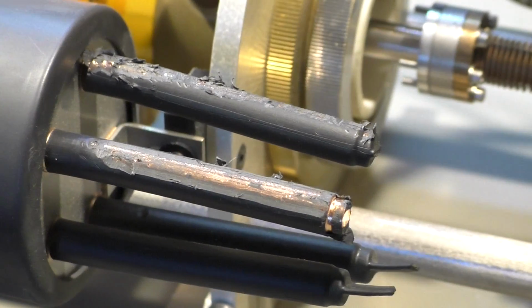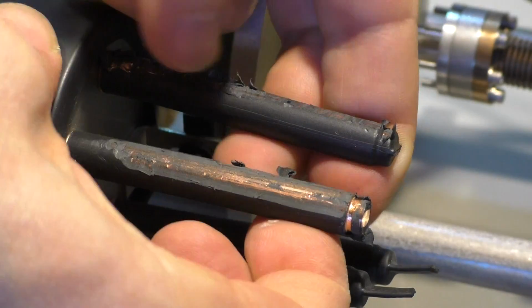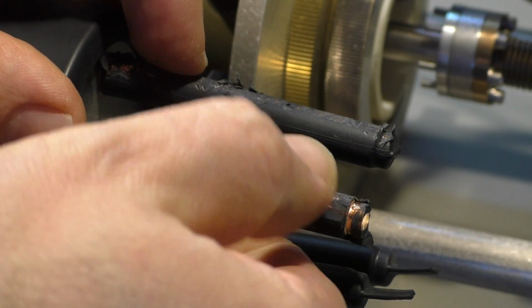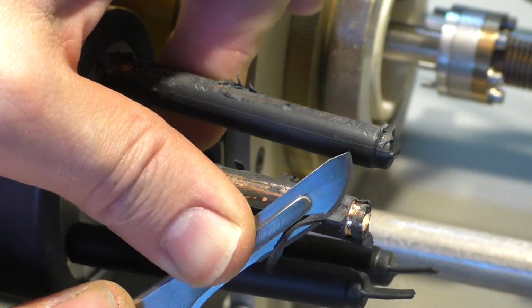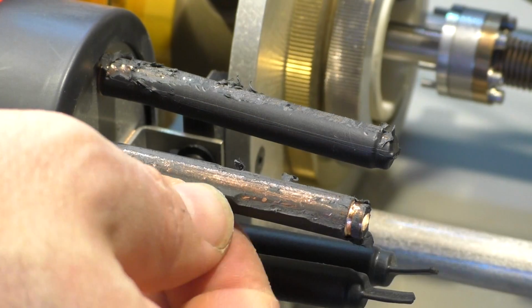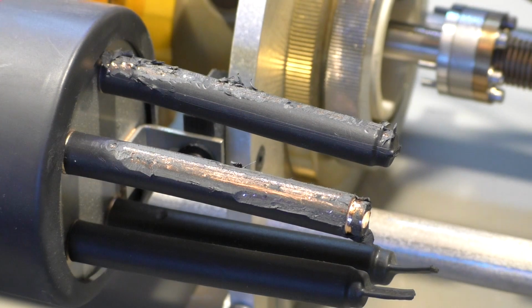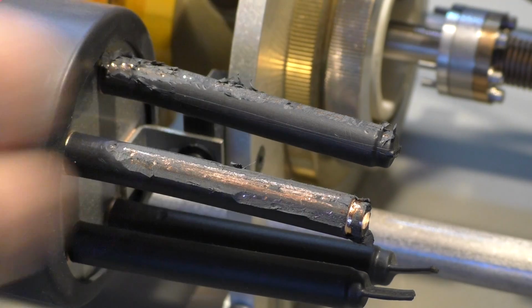Well, it's still a bit of a mystery. It looks like a copper tube, or 4 copper tubes. The plastic here seems to be a little bit more than just heat shrink tube. It's like dipped into this plastic stuff. It could be a heat pipe that goes into the tube to remove some of the heat of the gas if it gets hot, but I'm absolutely not sure if that's true.